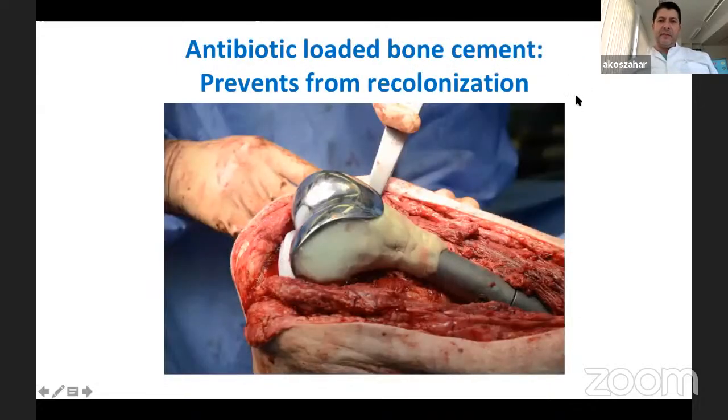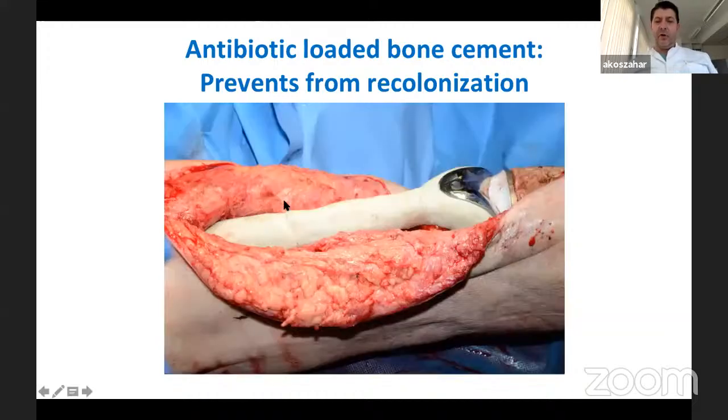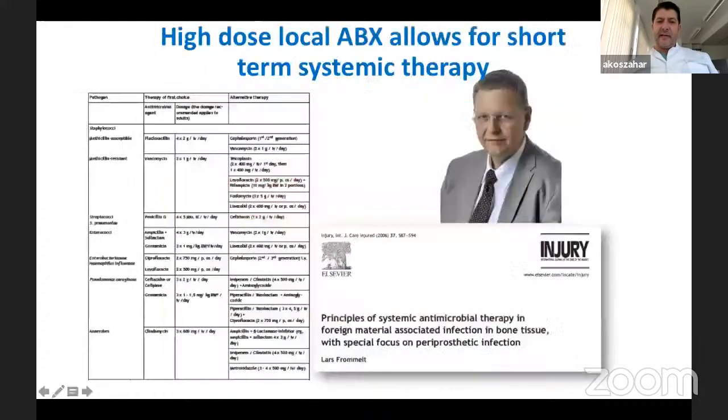Antibiotic loaded bone cement is very important to use. Also, when you use uncemented implants, you can combine it with antibiotic loaded bone cement, in this case, to coat the implant, and the release of the antibiotics from the cement can provide a high concentration of antibiotics in the joint. You can cover the whole implant. This is a total femur replacement, and it was covered with antibiotic loaded bone cement in order to provide a high concentration of antibiotics.